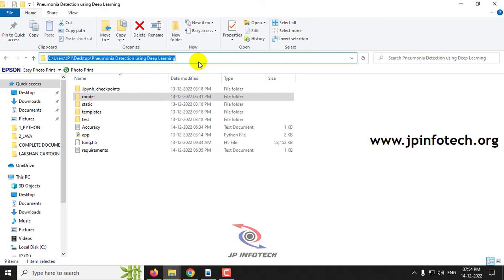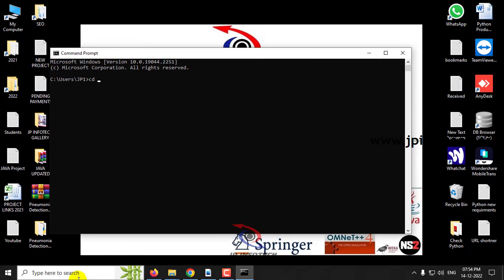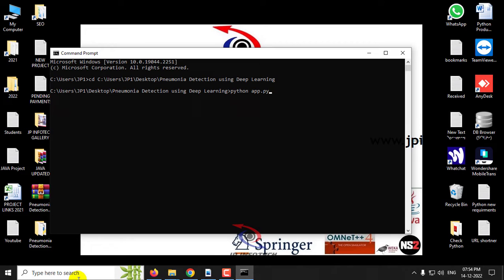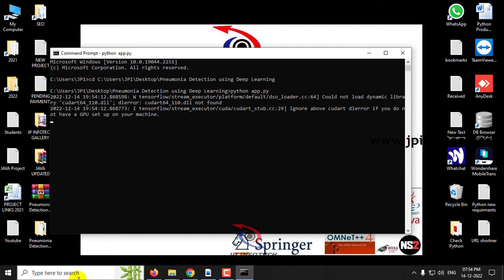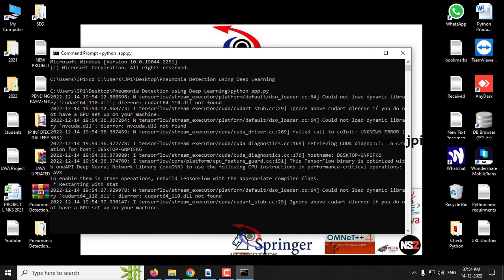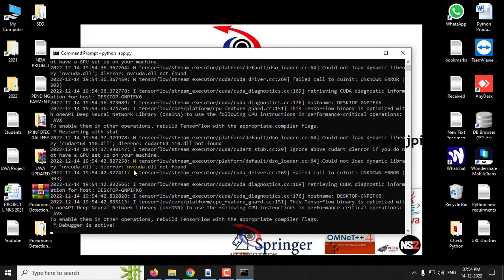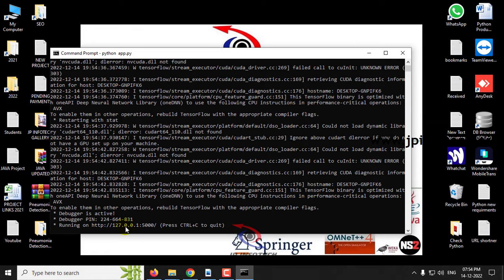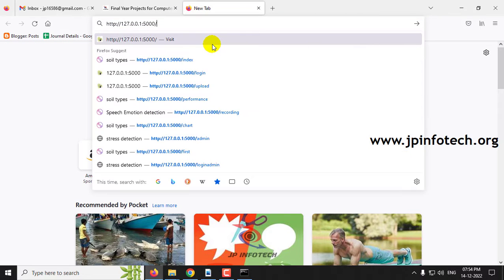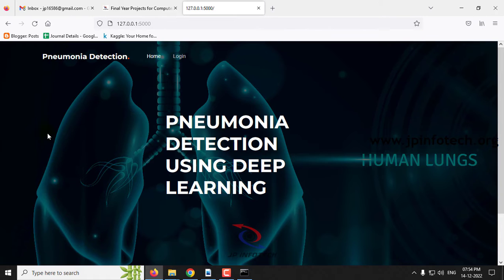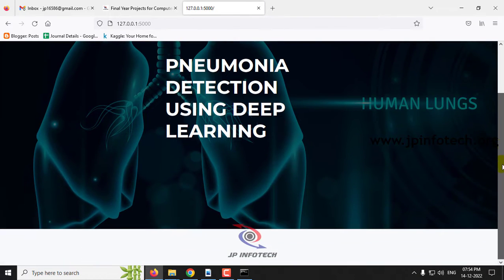Now copy the source code location, go to your command prompt, navigate to the source code location, type 'python app.py' and click Enter, then wait a few minutes. Once it starts, you will see a URL — copy that URL, go to any browser (I am going to Firefox), paste the URL and click Enter.